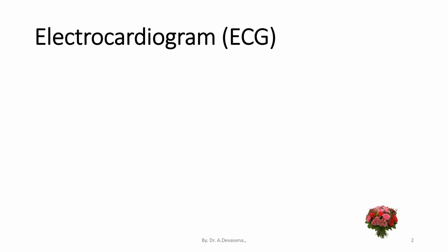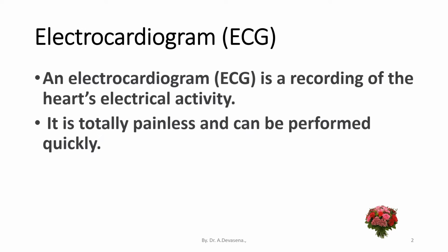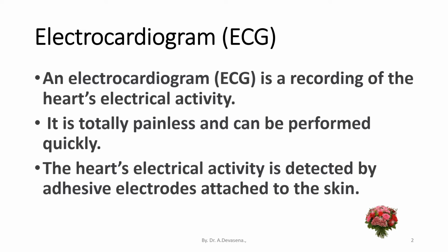Electrocardiogram, ECG. An electrocardiogram is a recording of the heart's electrical activity. It is totally painless and can be performed quickly. The heart's electrical activity is detected by adhesive electrodes attached to the skin.